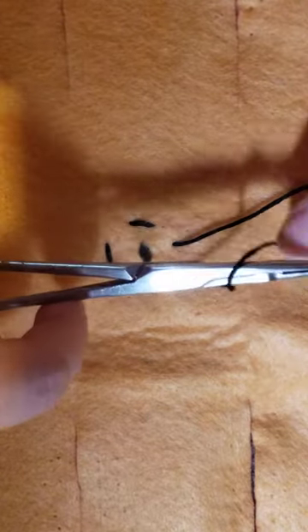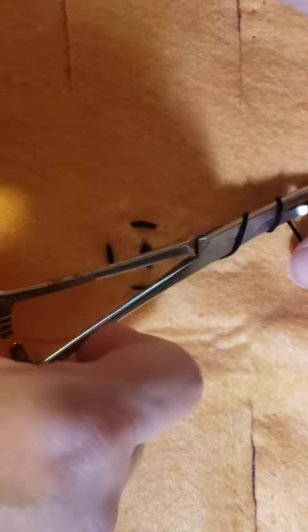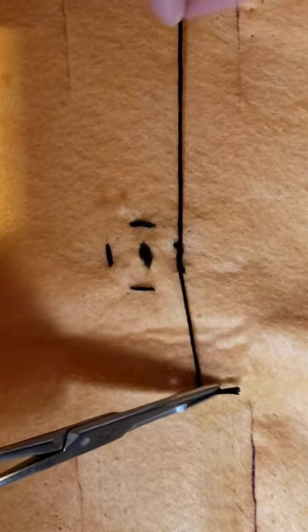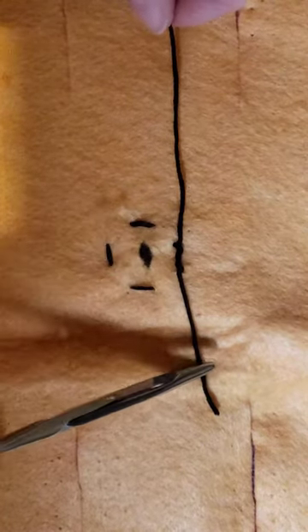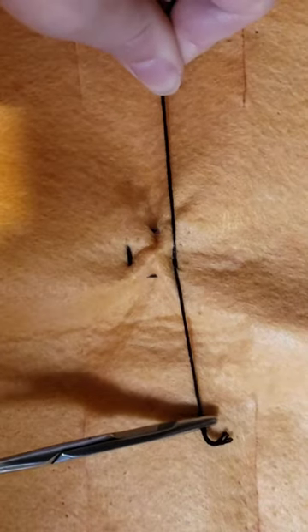Now, remember, I did say this is something that you're going to want to cinch the opening closed. So, be ready to pull a little bit snug on your sutures. Line your needle holders up between the tail and the needle portion. Wrap around twice for your suture or your surgeon's knot, or surgeon's throw. Go ahead and pull through. Remember to keep your knot or your throw lined up in a straight line. And then we're going to cinch closed. Okay, then we're going to let go.